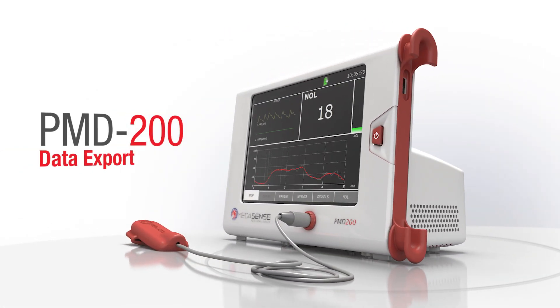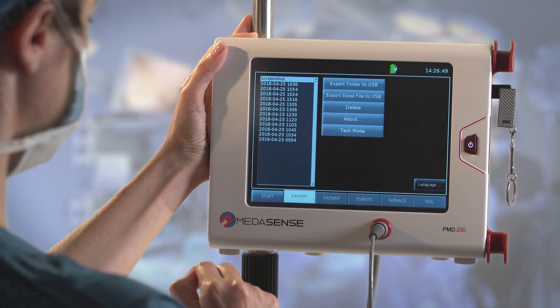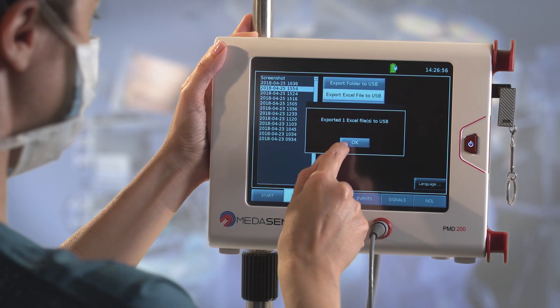Data export. If you wish, you can export the monitoring sessions onto a flash drive. Press the Export button and choose the required session, then export the Excel file to USB.